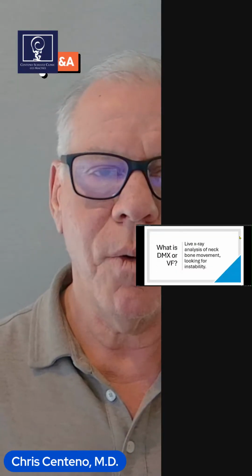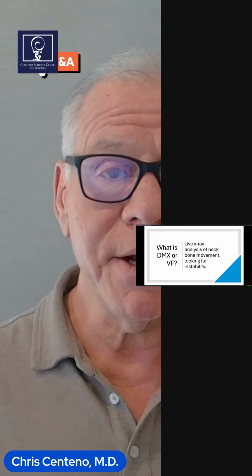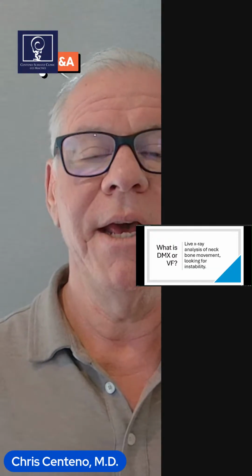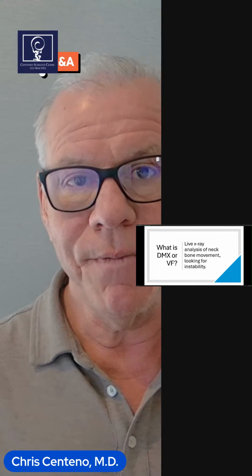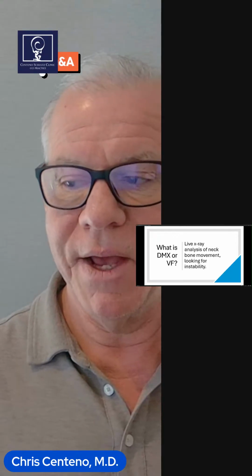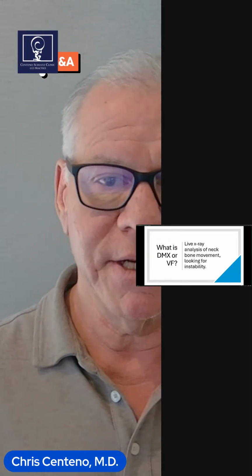So what is DMX, also called video fluoroscopy? It's live X-ray analysis of the neck. We're looking at bone movement, looking for instability. Now, what is instability? Instability is movement beyond what's normal. That doesn't necessarily mean it's causing symptoms, but it's helpful in determining if things are moving too much, and then we can try to connect that excessive movement with whether or not it's causing this particular patient's symptoms.